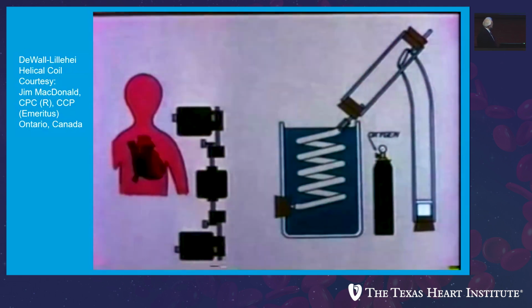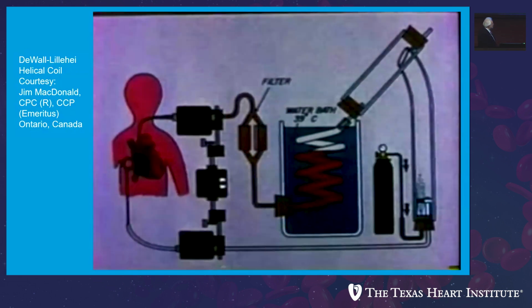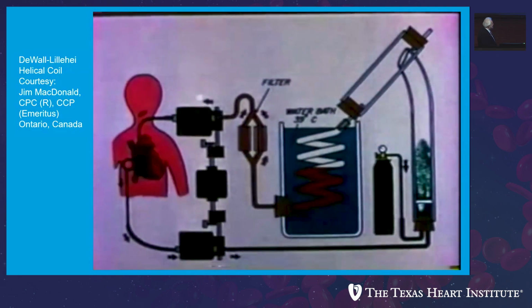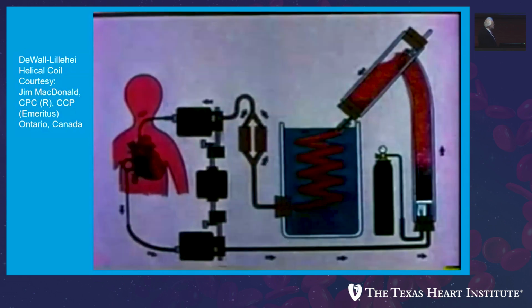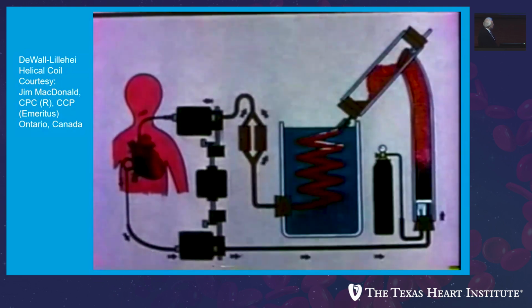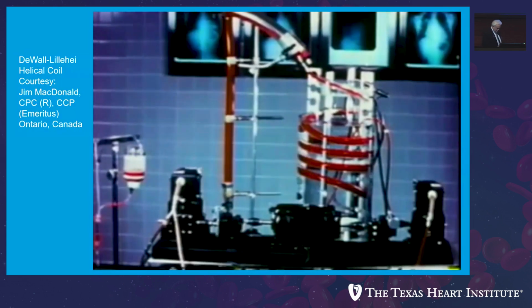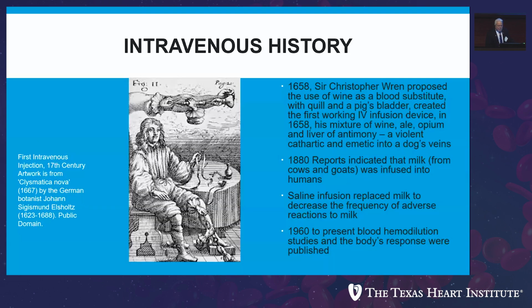In this extracorporeal circulation hookup, the patient is on the left, the Sigma motor pump for cross circulation is in the center, and the disposable bubble oxygenator is on the right. Operations were done under normothermia. The oxygenator reservoir is immersed in a water bath to control temperature deviations. Venous blood rises in the oxygenator mixing tube, enters the transverse debubbling chamber, and then into the final debubbling in the Helix reservoir in this 1955 model of the DeWall-Lillehei Helix Reservoir Oxygenator. The water circulating you saw around the helical coil was to rewarm the patient and things like this. So there was a lot of work left to be done, and very quickly.